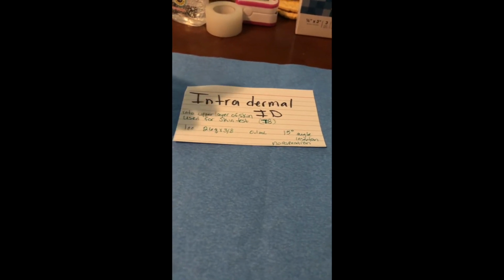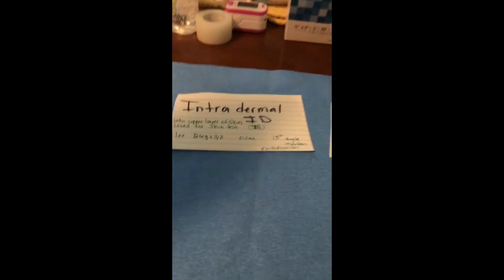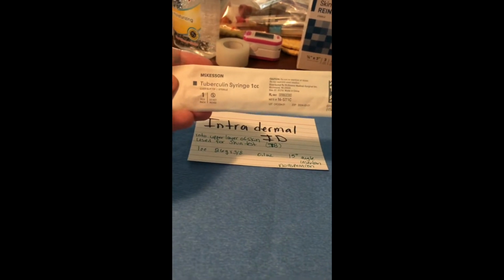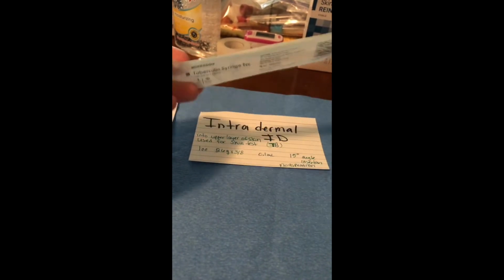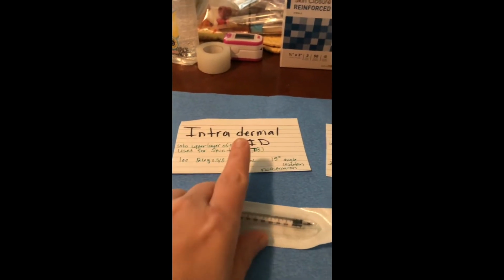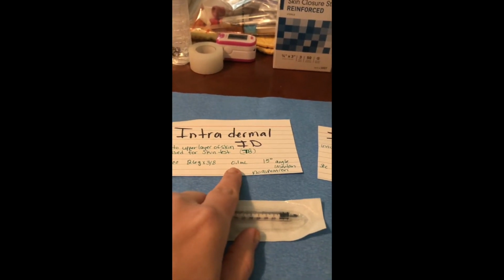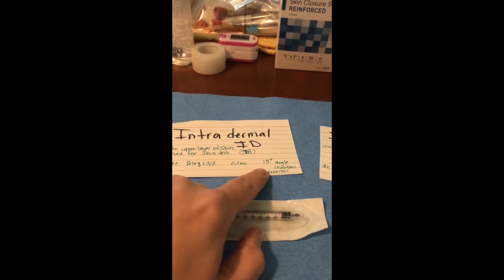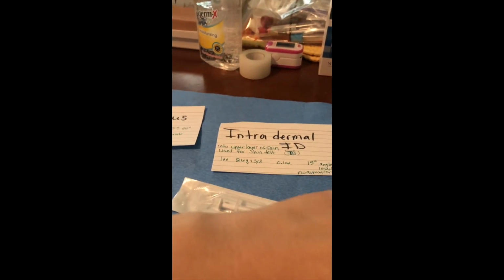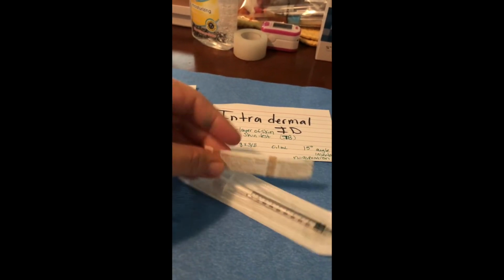Intradermal, that's most commonly what you're going to hear as a TB skin test. It's just what it says: it's under that first little layer of skin. It is going to be this little syringe. It's even called tuberculin, 1 cc. The max that we're going to use is 0.1 mLs. And this one's done at a 15-degree angle of insertion with no aspiration. The needle that we're going to use for this is 26 gauge by 3/8.